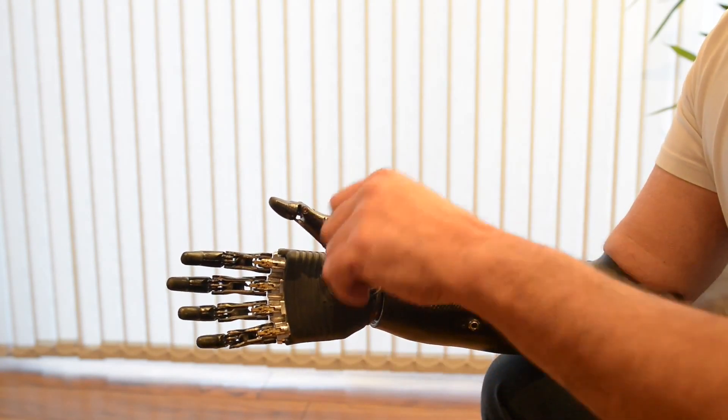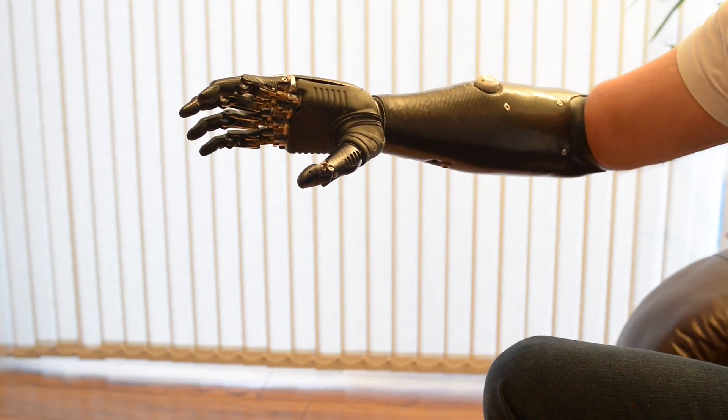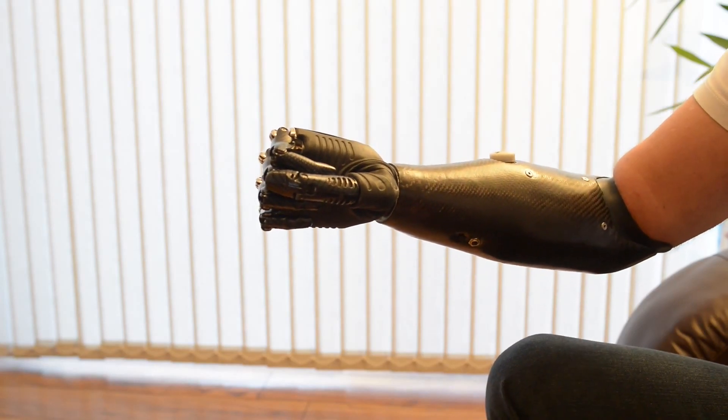We then move the thumb to this position and we can get a tripod grip, so picking up small things. We can then change the grip again. This is power grip — this is for heavy things. This is for shaking hands. This is for being human.